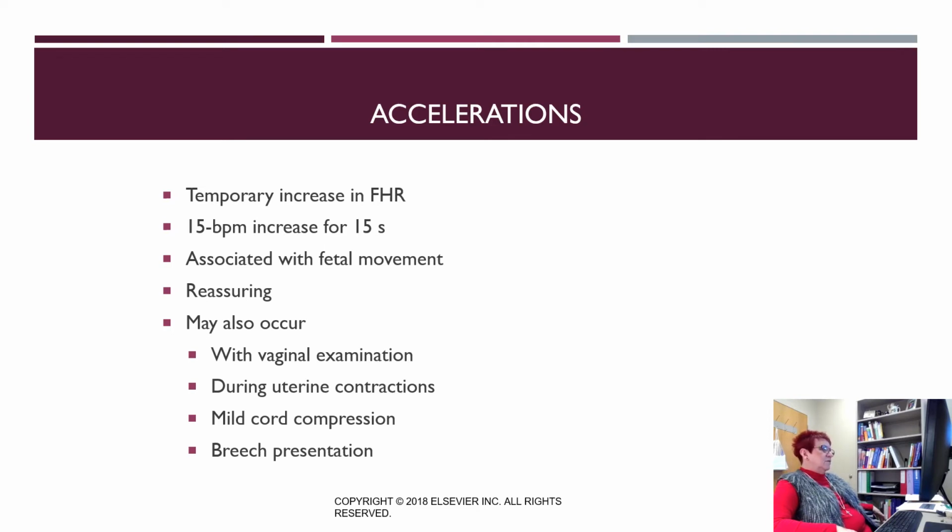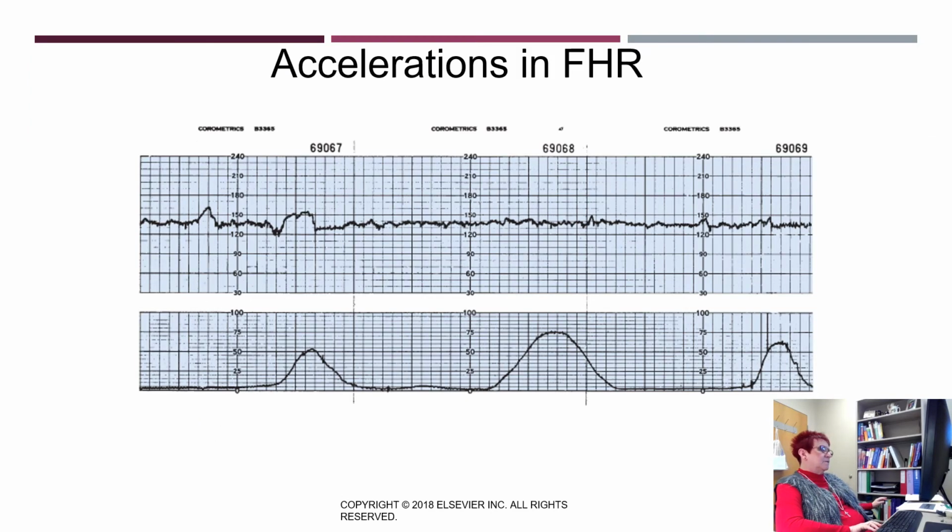Sometimes we can get some accelerations with a vaginal exam, sometimes during contractions, mild cord compression, and then oftentimes with a breech presentation. So here's a strip, and I think we've seen this one before, but you can see we have some accelerations, and this is a very reassuring strip, very reassuring.